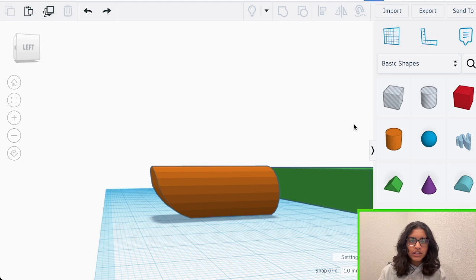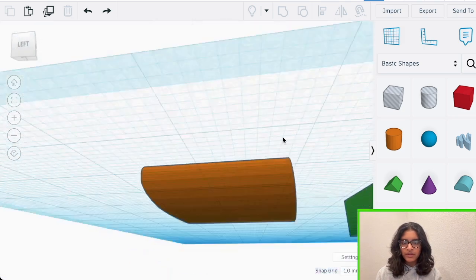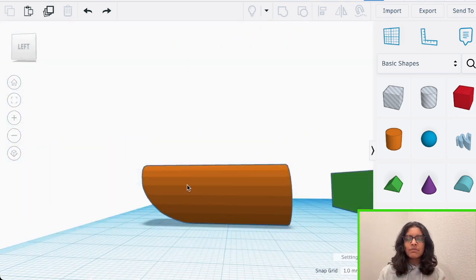Alright, so now that I've gotten rid of that extra shape that used to exist right here, I'm going to just carve out the bottom of this finger in a rectangular shape to just give it more of a natural view. Our fingers aren't complete semicircles, there's a flat surface right here, so I'm just going to add that within this design.